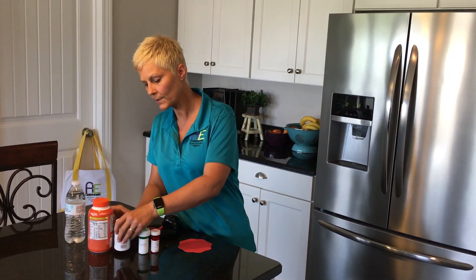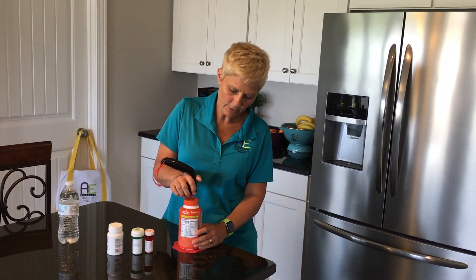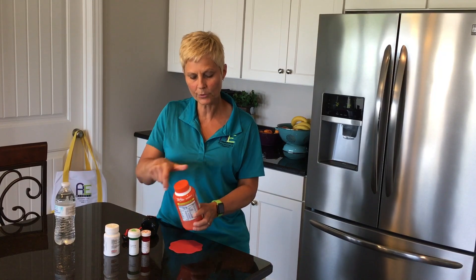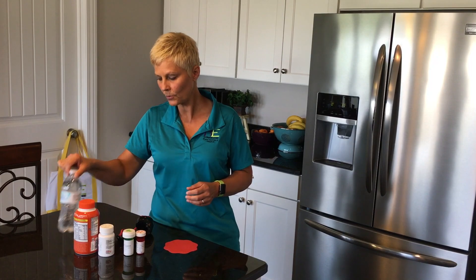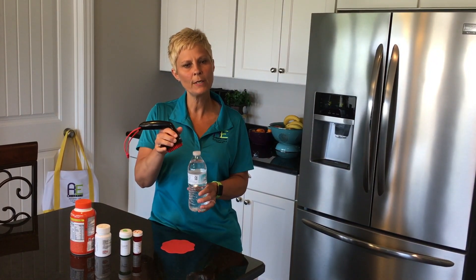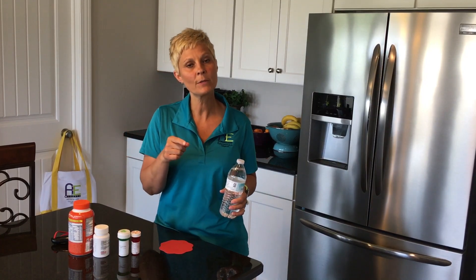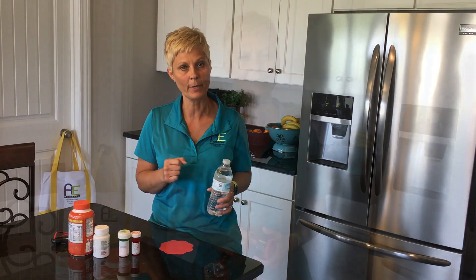This is a two-inch diameter lid on a vitamin bottle. This one will work — I'm using the same technique grabbing it this way, though I did have to use a second hand to help loosen that lid. I also attempted to use it on a water bottle, but it does not quite have the grip needed for that. Check out our video on adaptive equipment to open cans and jars, because there are some things in there that will help with a water bottle.